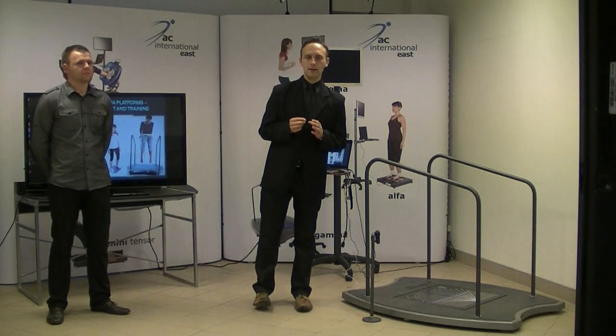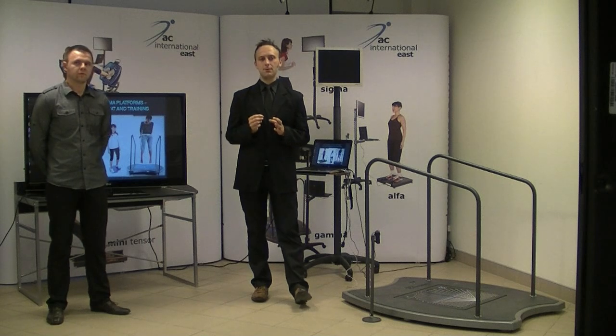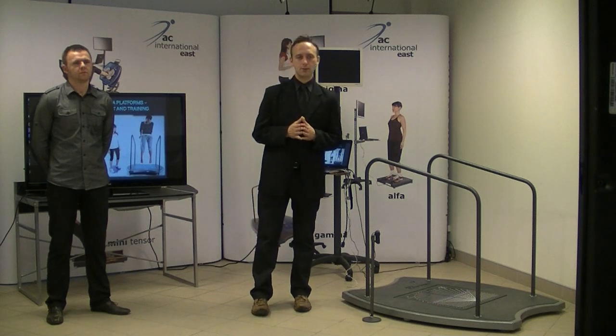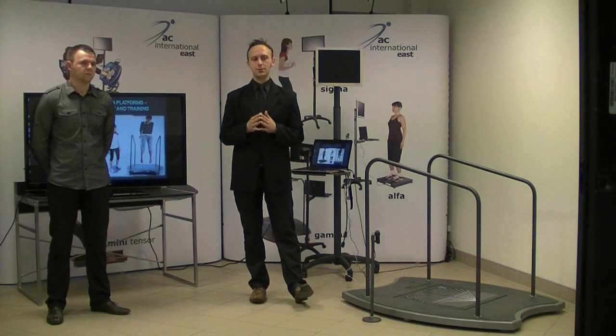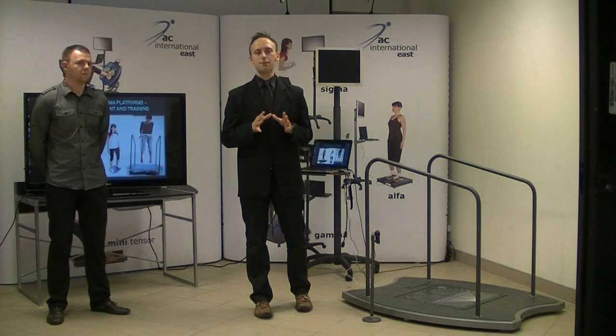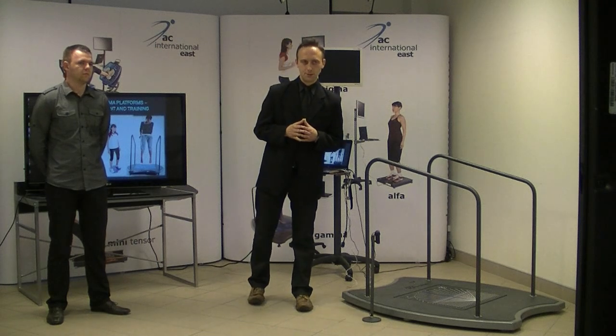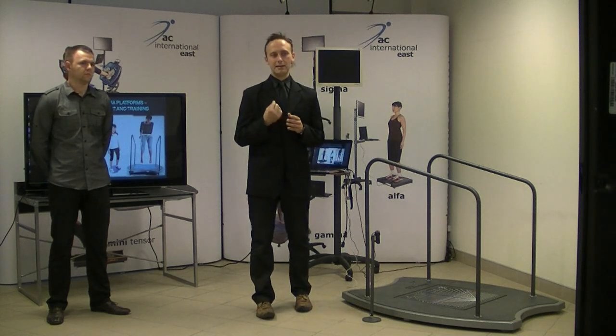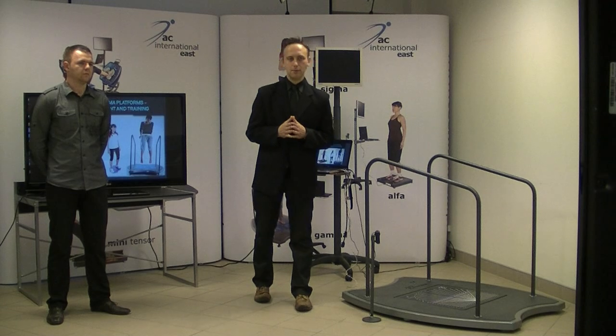We also have more attractive exercises designed to stimulate and improve the neuromuscular coordination and the reaction time. And the platform is also an excellent tool in the growing field of fall prevention. So we have a good diagnosis, proper selection of exercises, and an effective rehabilitation procedure.